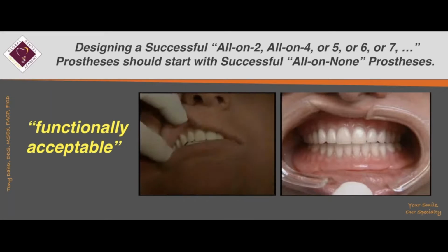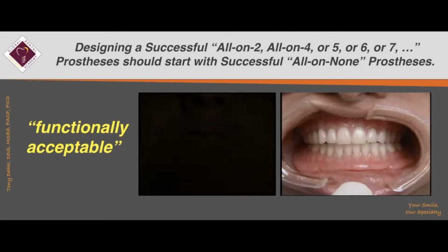Okay, that's it. So now I'm going to show you the same patient. I made a new set of dentures for her. Now, the interesting thing is if you retract the lips and retract the cheeks, what's going to happen? You ask the patient to move left and right, and if the occlusion is balanced, then the mandibular denture or the maxillary denture will not move. They stay put.